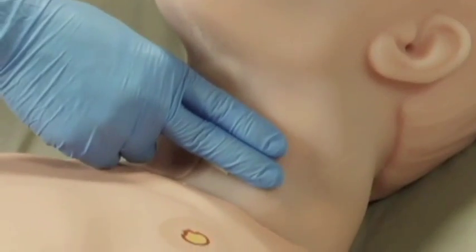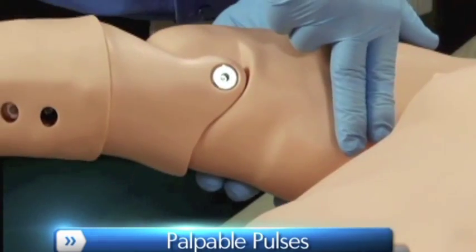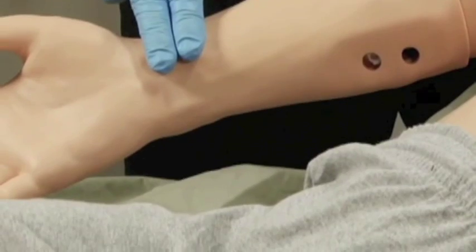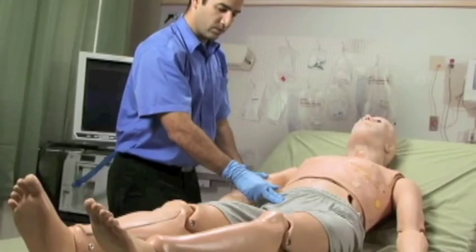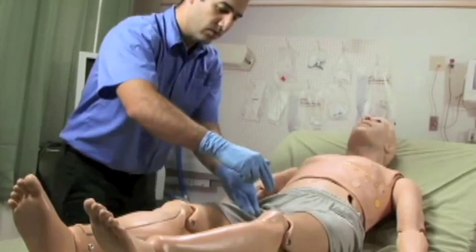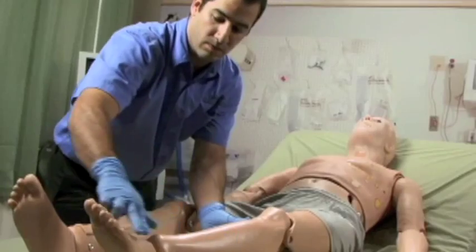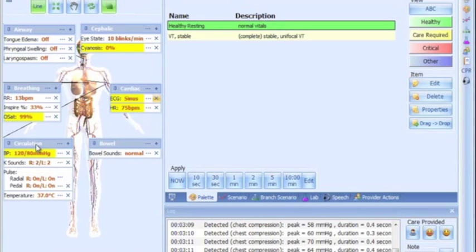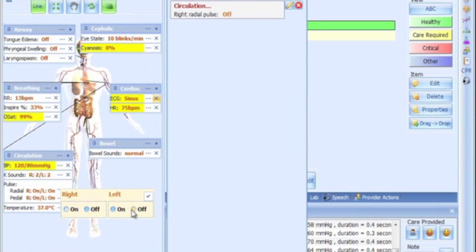Bilateral carotid, radial, brachial, femoral, popliteal, and pedal pulses operate continuously synchronized with ECG. Pulse strength varies with HAL's blood pressure, and distal pulses can be disabled to simulate severe hypotension.